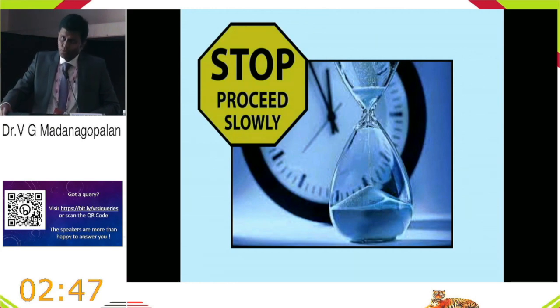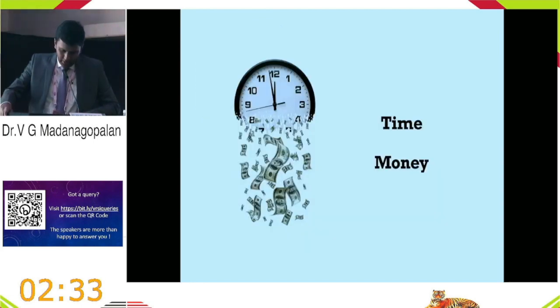When it comes to the next two points, IOP control under air and field of illumination, all that is required is that we proceed slowly, have a little patience, and anticipate things before they happen. Don't wait for things to happen and then react. That would require a little bit of time. Come on, we're all VR surgeons. We're not competing with cataract surgeons. Try and finish the surgery in 10 minutes or 5 minutes.